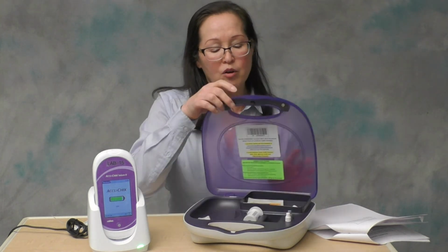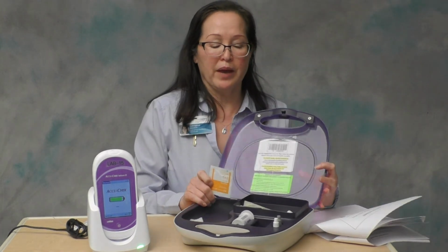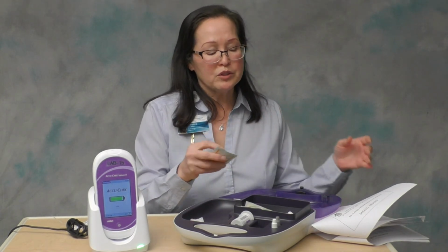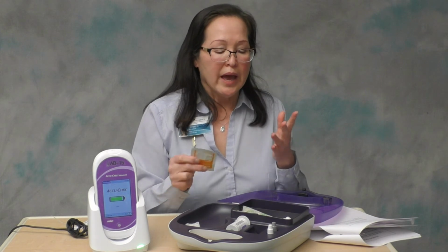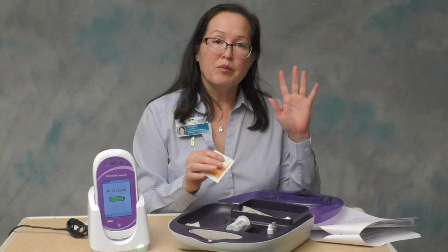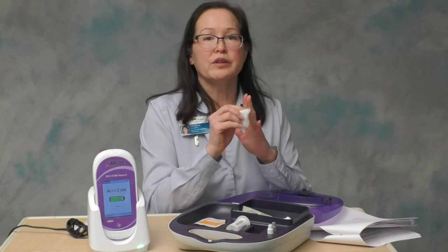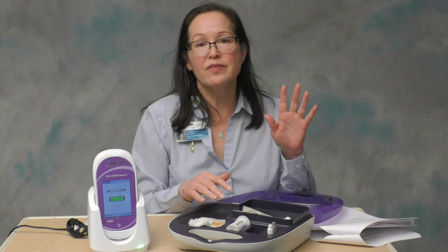Then you're going to use alcohol. All the supplies are located in the tote. You can use an alcohol prep pad once you've made your selection to clean the finger off. And most of these patients are frequently testing their fingers, so I always like to ask the patient which finger they would want me to use. You're going to clean the finger off with alcohol. Make sure you allow the alcohol to dry completely or wipe it dry with a piece of gauze. If the alcohol is wet on the finger when you lance it, it's going to lyse the red blood cells, and that can give you an inaccurate test result also.